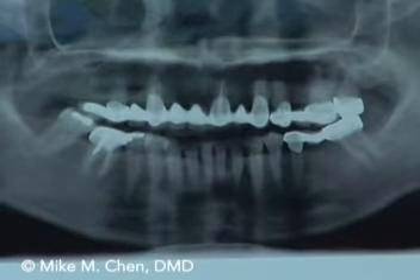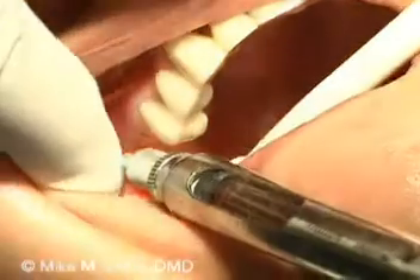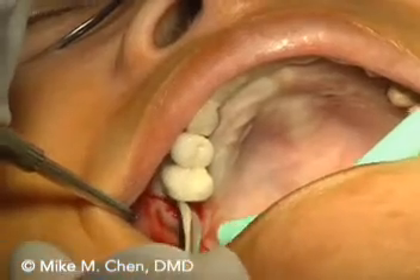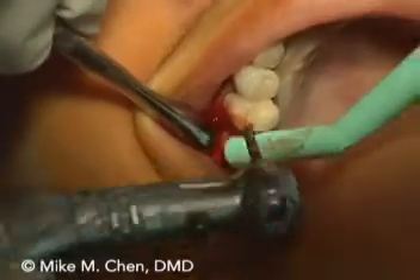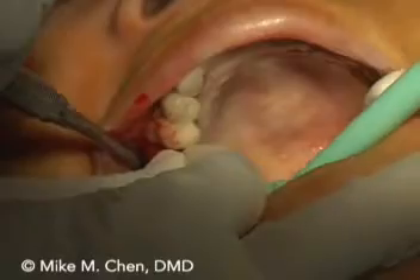In this case you'll see on the upper right side where there's a missing molar area and the height is pretty good. We're going to place a lengthy implant, about 10mm in length, but the bone level is probably about 8mm in height. The doctor wants to do a little sinus bump. So if we measure the bone to be about 8mm, we will drill to 6 or 7mm, leaving 1 or 2mm of bone, then use the sinus bump to push the remaining bone up — what we call a fracture. Once we do that, we size it up to the actual implant diameter and place the implant.